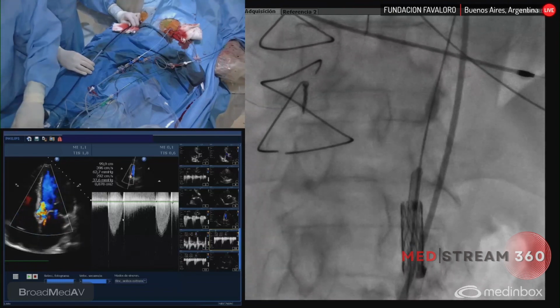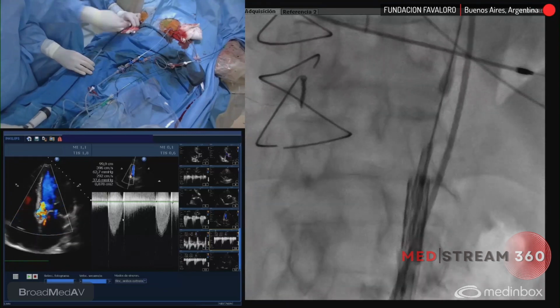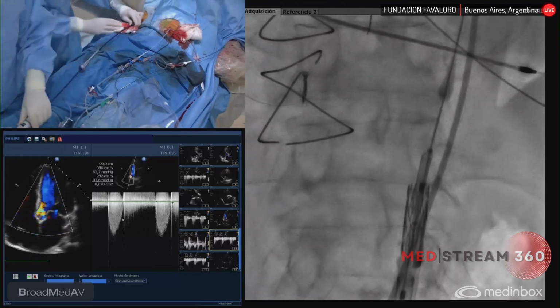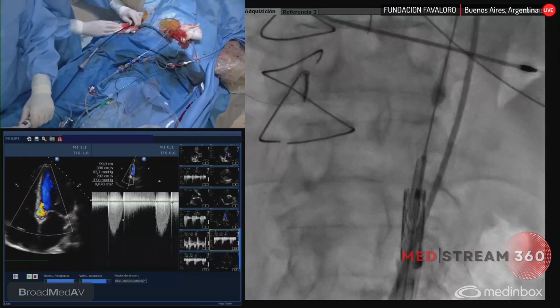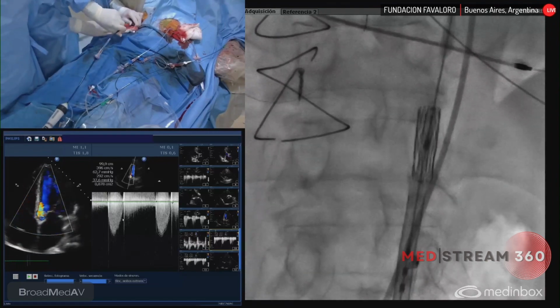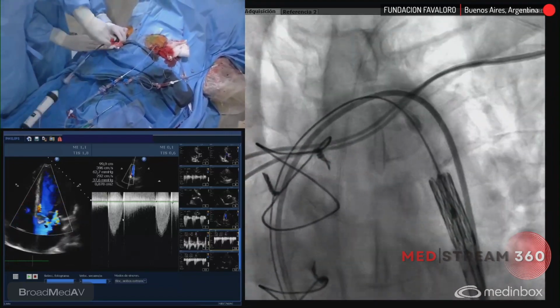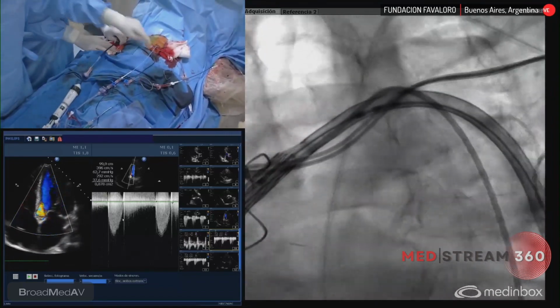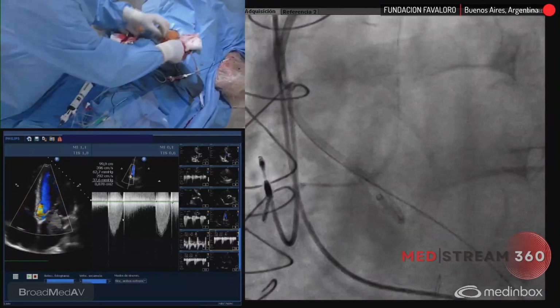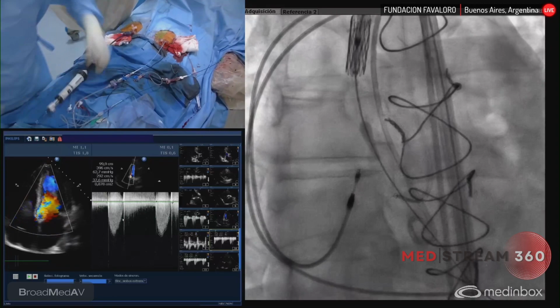Okay. And now we have to hold it here. No. We have to introduce the balloon. Tiene que montar. Okay, we are ready. Let's go. Vamos arriba. Dale una adrenalina acá en el venoso vos. Bueno, rotate. Por ahí vete.